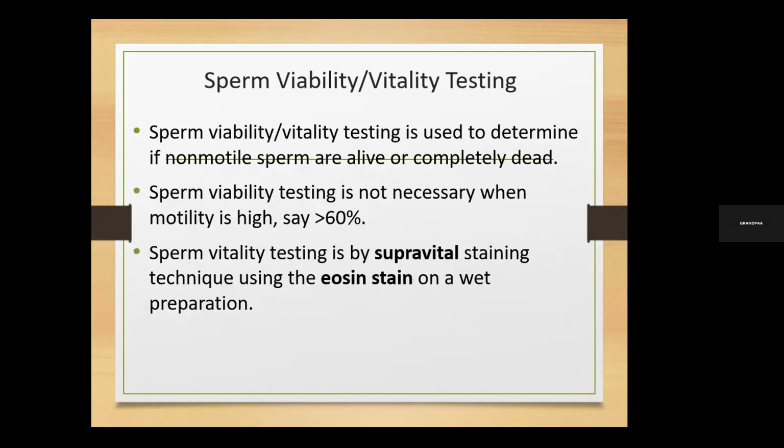So we are doing the sperm viability or vitality testing. We said that you should be able to know how to do this procedure, but it's not that you do it for every test. I think that you've said it severally. You don't do it for every test.